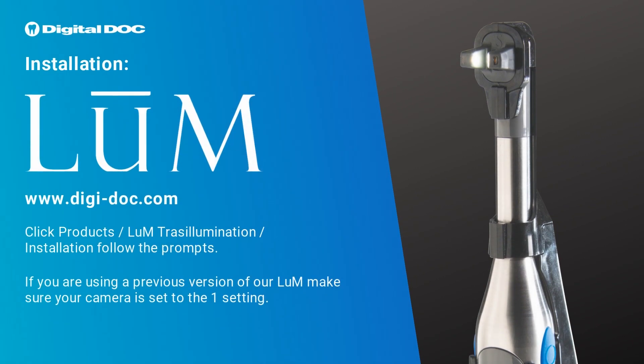Installation: if you are using a previous version of our camera, such as the Iris 2.0, make sure that your camera setting is on the one position. With the X80, it's an autofocus camera, so you don't have to set the focal settings at all — it just does it for you.